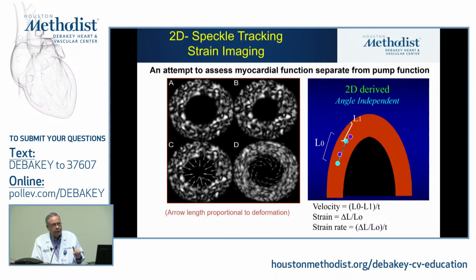All right, let's talk a little bit about speckle tracking. So what allows 3D speckle tracking, and we're not going to talk about it today because it's still more theoretical, it's still more in research than everyday practice, is AI. But all of these techniques, new techniques, are based on one important fact. Anybody can tell me what's the important fact that makes all of these things possible?